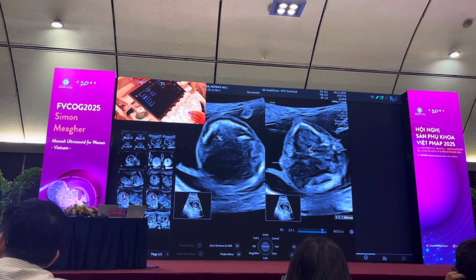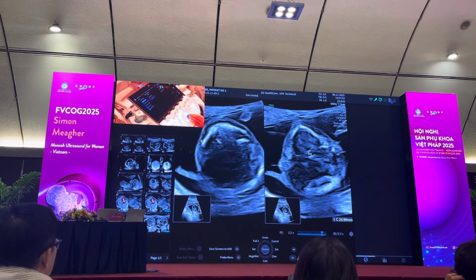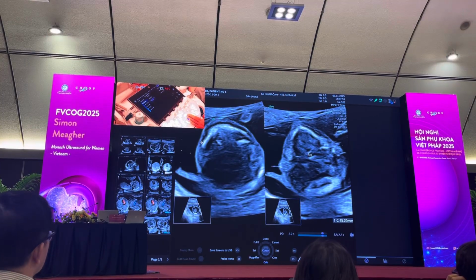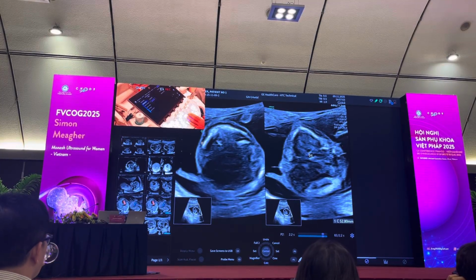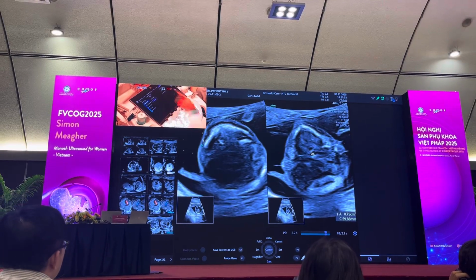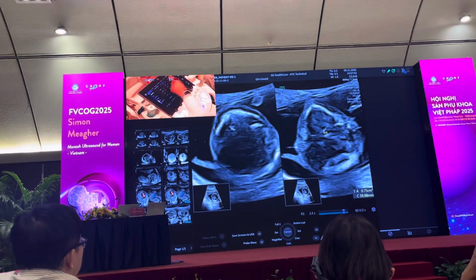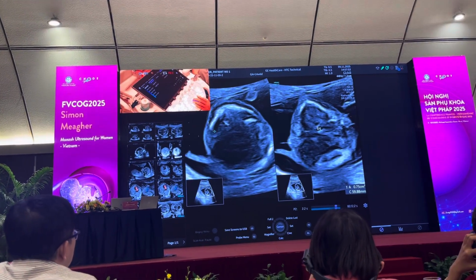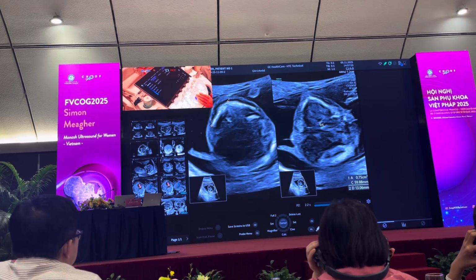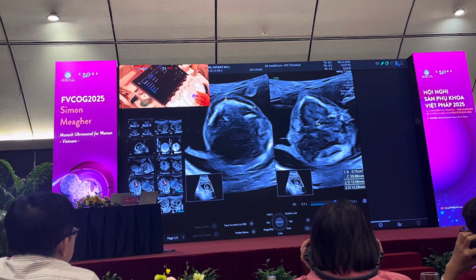Because this here, if I trace it out, is all the upper lip. And the upper lip is intact in this baby all the way around. And I know it's the upper lip because I can see the shape of the maxilla. The maxilla is a wide angle bone. I do a generic distance measurement. If you look at here, it's a very wide angle bone. Whereas the mandible is a very tight angle bone. Look at the angle of the mandible.